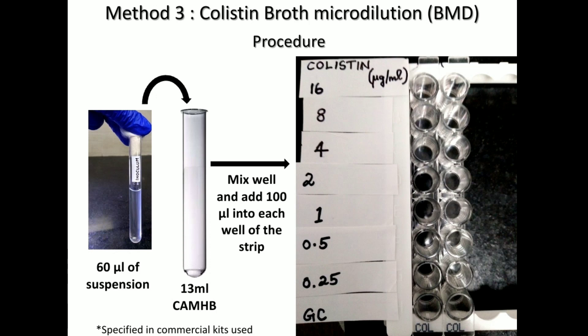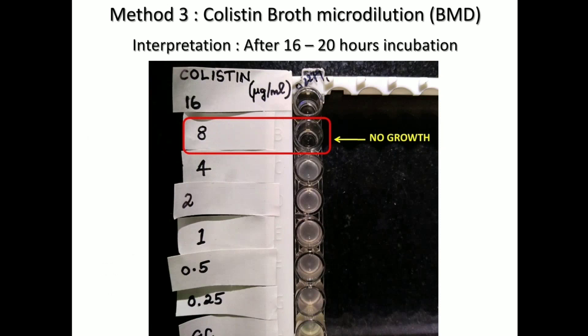You take 60 microliters of the inoculum added to 13 ml of cation-adjusted Mueller-Hinton broth, mix well, and add 100 microliters into each well of the strip. One strip should be used for one isolate. Here we have tested two isolates. Note that the procedure may vary slightly with different kits.